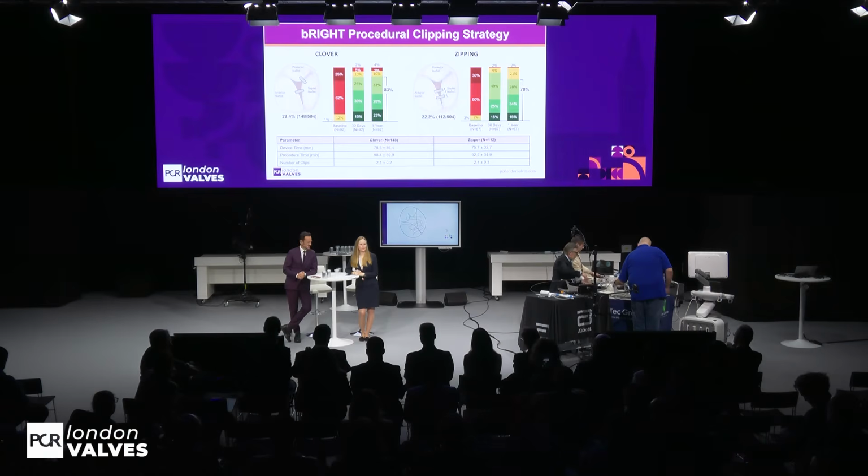Alrighty, so with this evidence wrap up, we're going to part 2 now. I'm going to ask our case presenters, first of all, Philip Nicolai, who is showing us a case. Both of the next 2 cases are dealing with pacemaker leads or transvalvular leads, another very challenging anatomy. First of all, we are going to see a very short presentation of the first case, starting with Philip Nicolai.